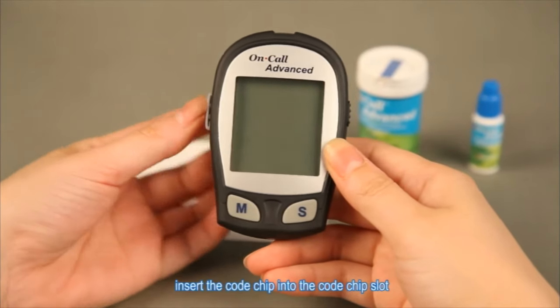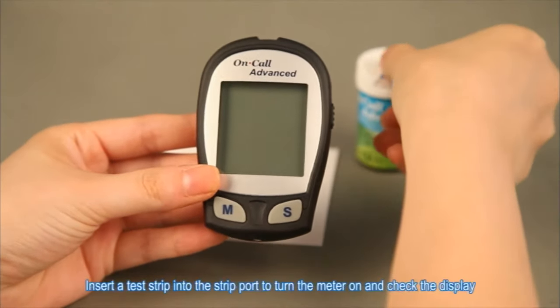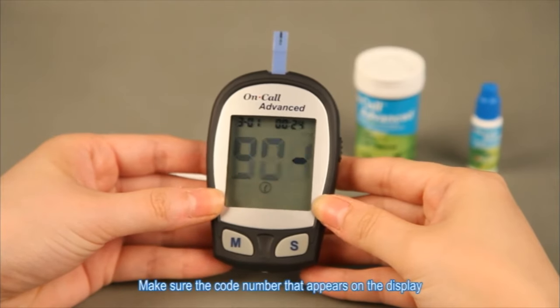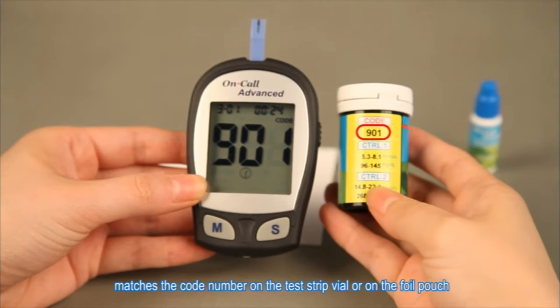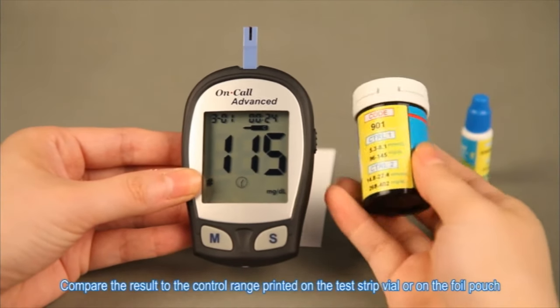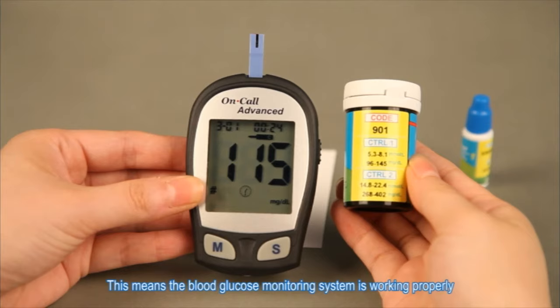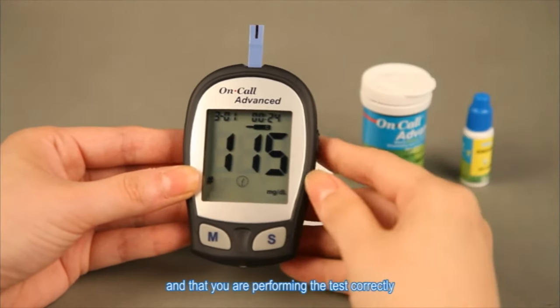The video instructs: 'With the meter off, insert the code chip into the code chip slot. Insert a test strip into the strip port to turn the meter on and check the display. Make sure the code number on the display matches the code number on the test strip vial.' Oh, I forgot to put the strip in! It says E4 — what does that mean? I obviously have to put the strip in before I prick my finger. Why am I like this?